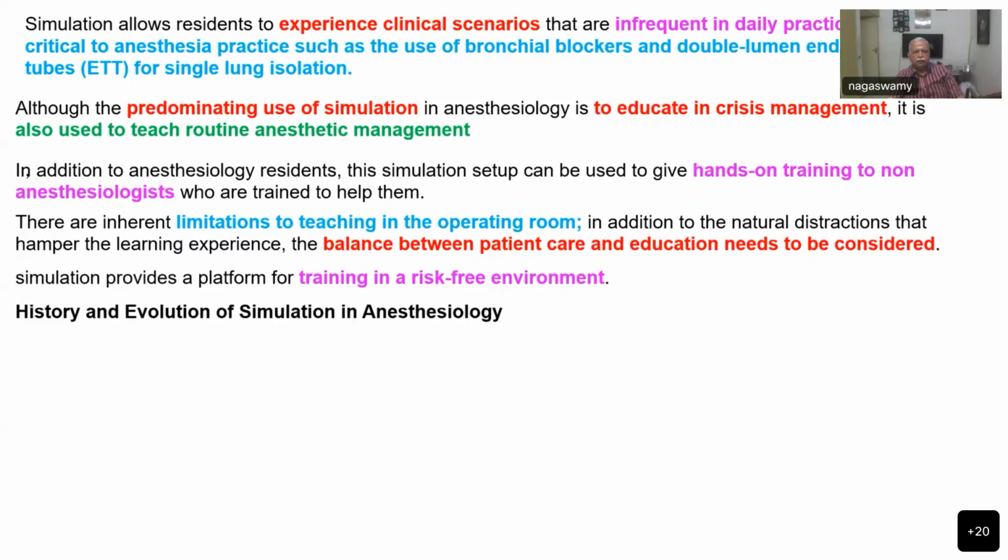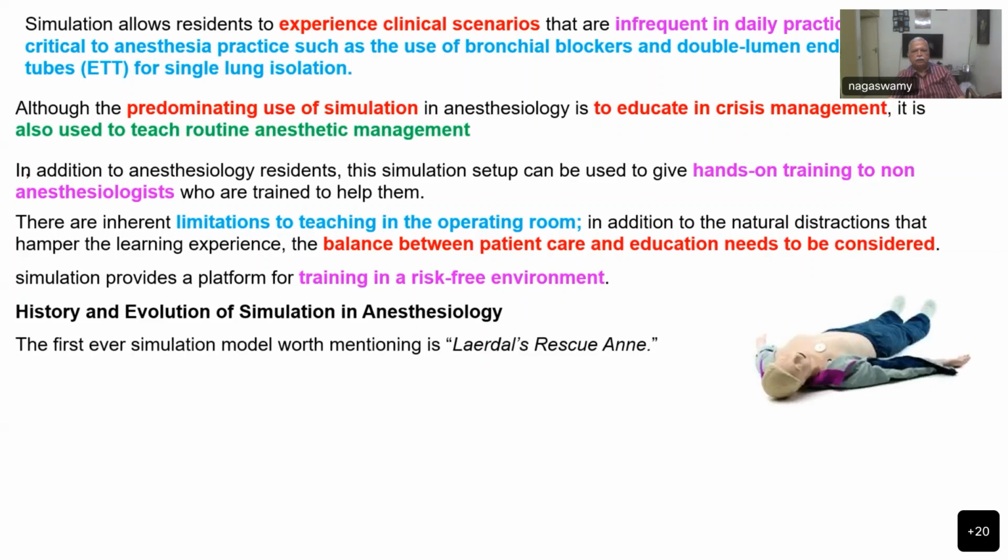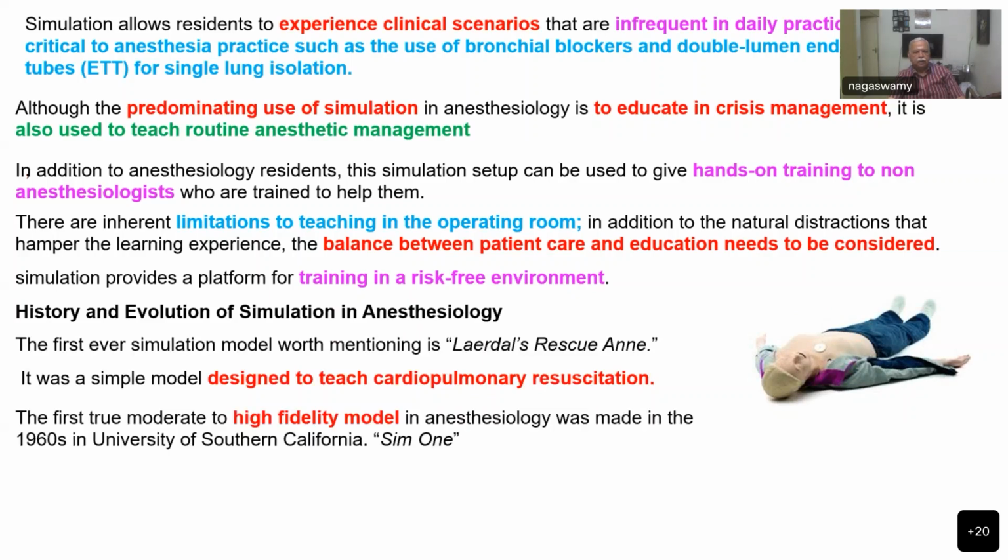Coming to the history and evolution of simulation in anesthesiology, the first ever simulation model worth mentioning is Laerdal's Rescue Annie. This was the mannequin that was there. It was a simple model designed to teach cardiopulmonary resuscitation. So this was the first ever simulation that was used.